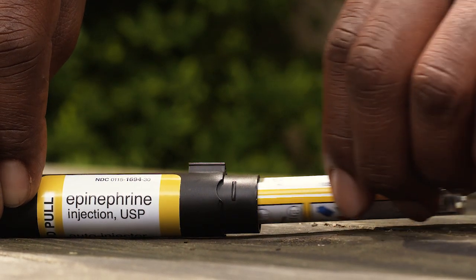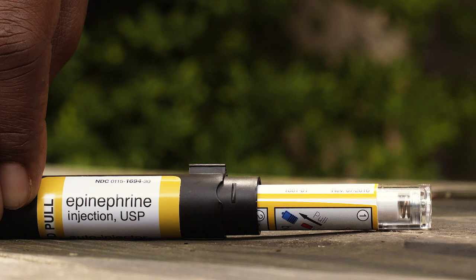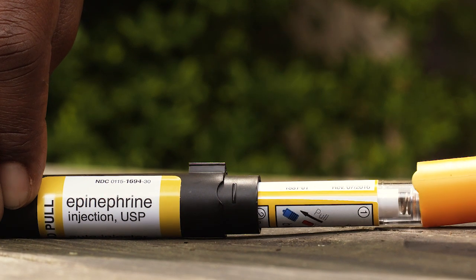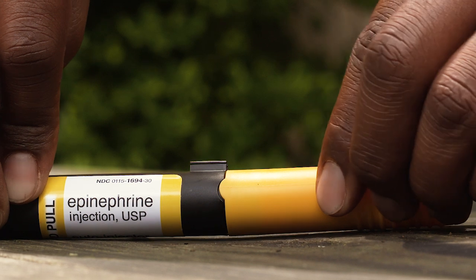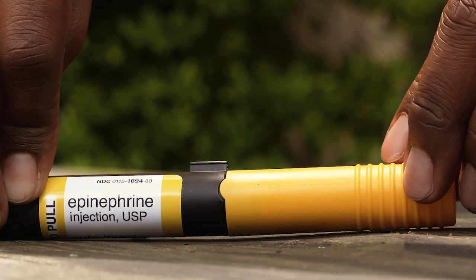Carefully slide the device needle first into the black carrying case on a flat surface. After the needle is inside the case, push the colored half of the case firmly over the non-needle end of the auto-injector. When you see a healthcare provider, tell them you've received an epinephrine injection. Show them where you were injected and give them your used auto-injector for inspection and proper disposal. Ask for a refill if needed.